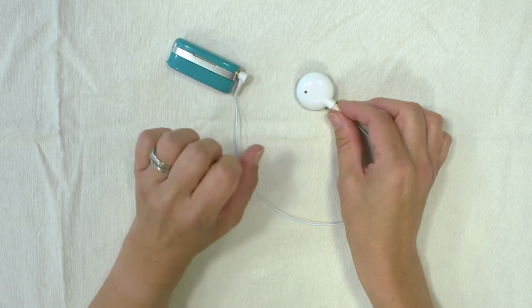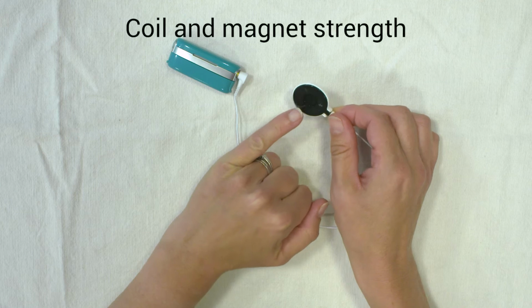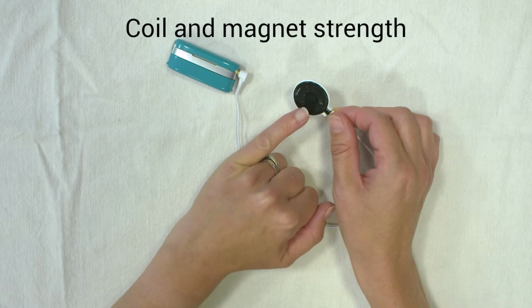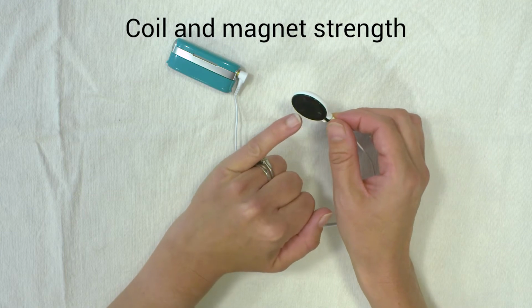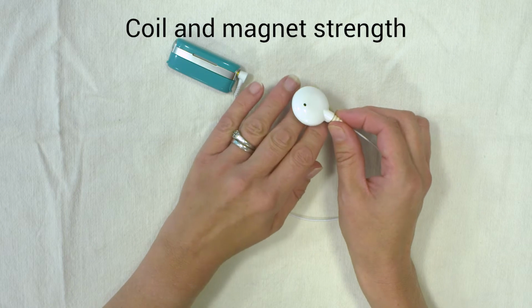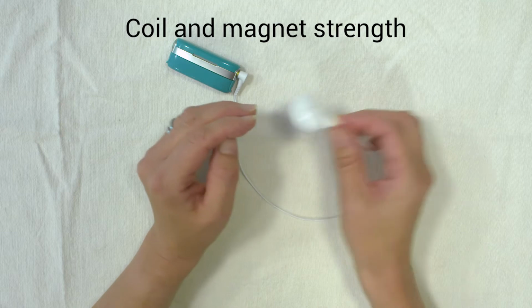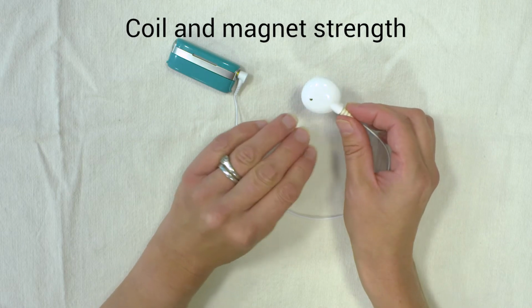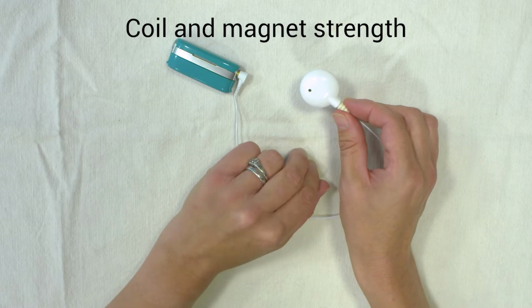The coil has a magnet in it. The audiologist will choose which strength magnet you need, and it's really important to get it right. If you make it too tight, you can cause damage and discomfort. And if you make it too weak, obviously it's going to fall off a lot. So the audiologist will spend time making sure the magnet is the right strength.